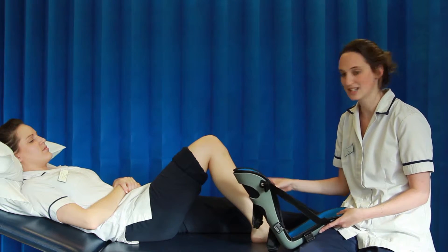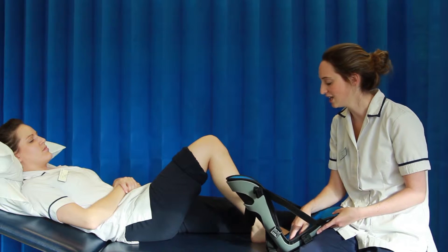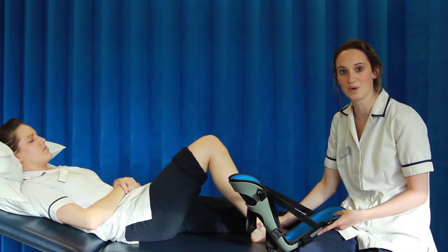To apply the splint you might need a second pair of hands to help move the leg and position it accurately, but if your patient can assist with this then one person will do.